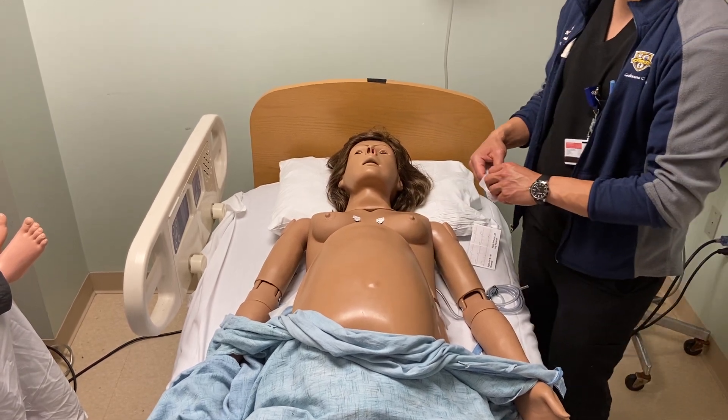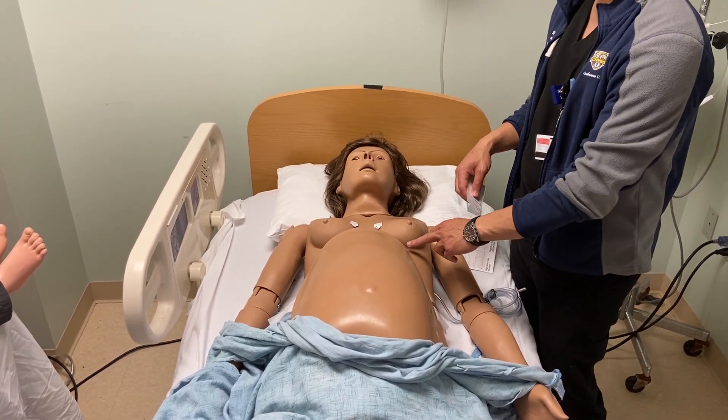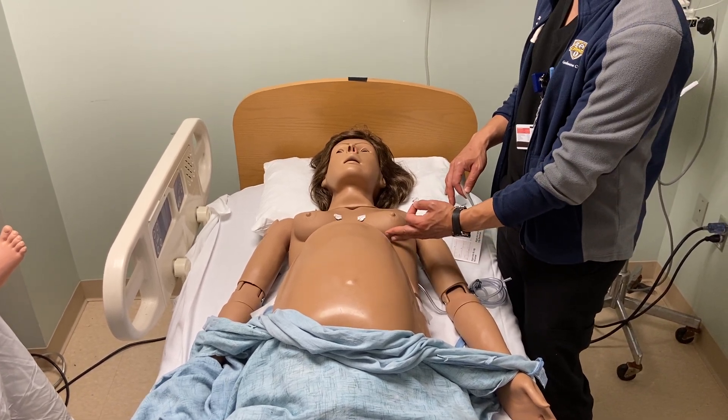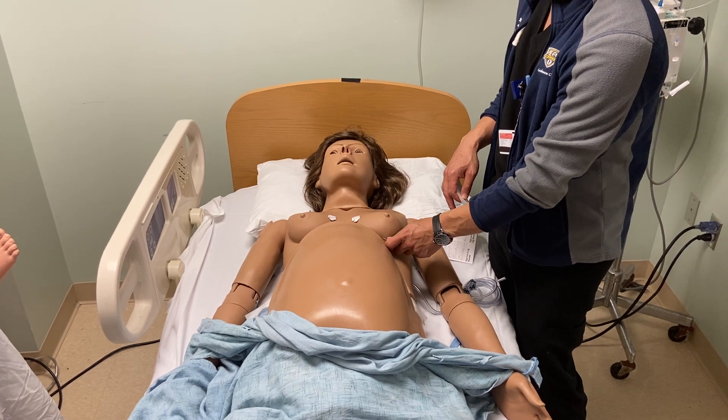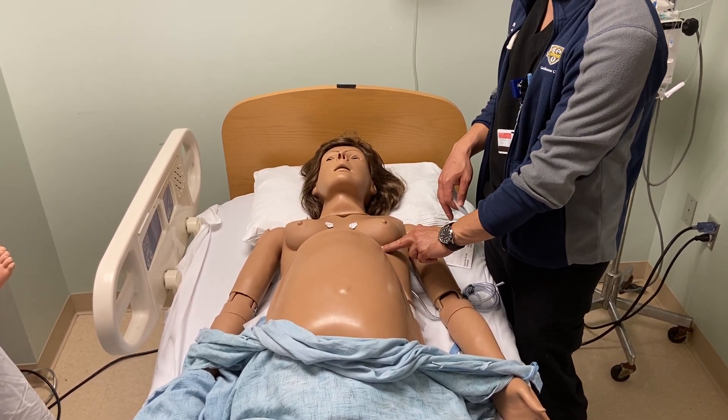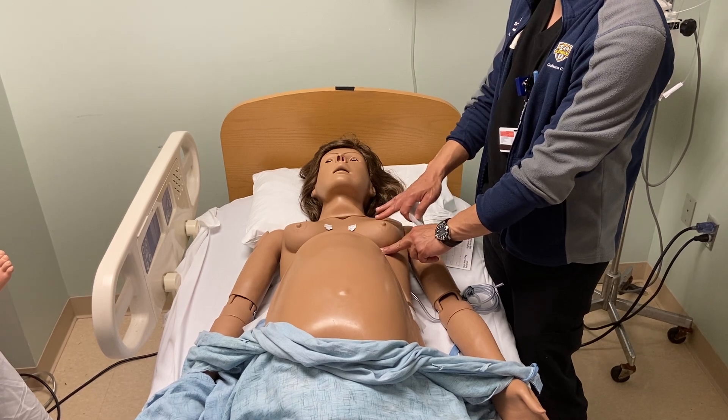We'll skip ahead to V4. For V4 to be most consistent, as best as you can, try to move the breast tissue upwards and place it right in the inframammary crease, which should approximate the fifth intercostal space in the mid-clavicular line.